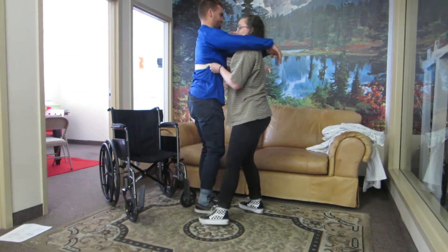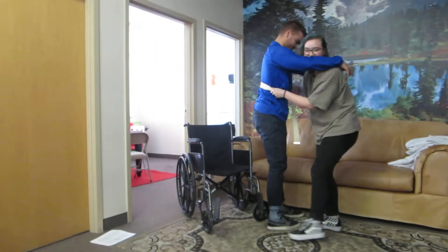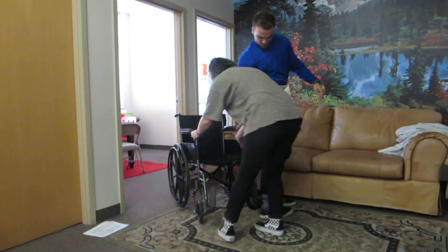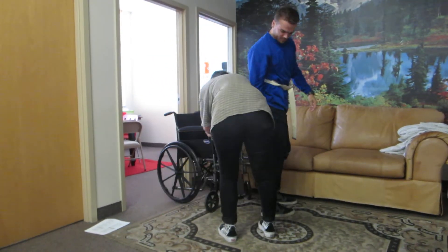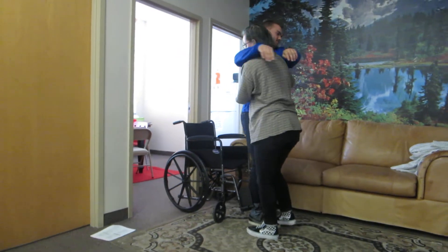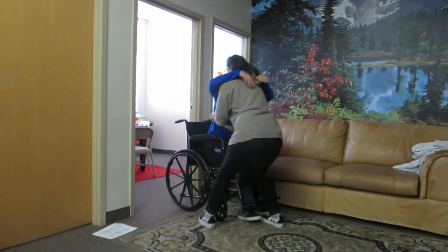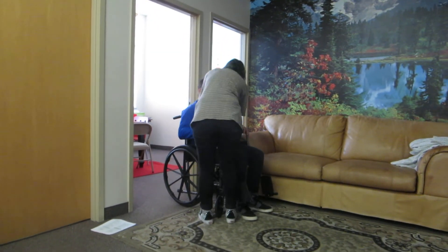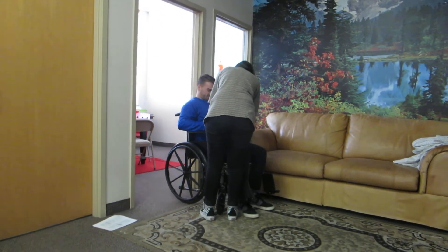Put your hands on me. You made a mistake there — the wheelchair was supposed to be locked. Hang on. Good job. Keep thinking though.